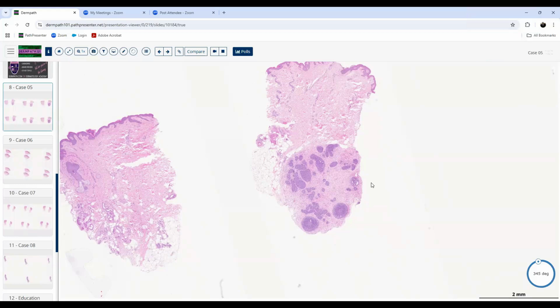You think when they saw this patient in the clinic, they said, ah, follicular tumor? Highly unlikely. But yeah. What do you think they did think? I mean, they took a punch excision of the lesion. What do you think they thought this was clinically? Did they think maybe this was a basal cell? I doubt it. To me, look how deep this thing is.